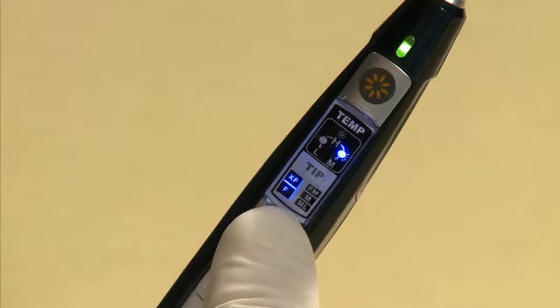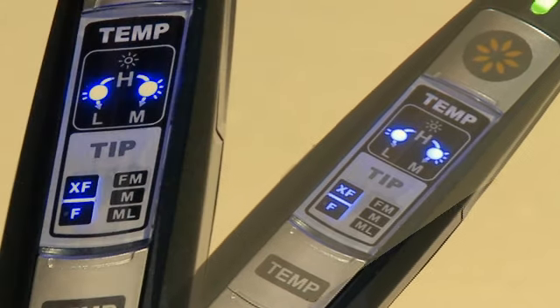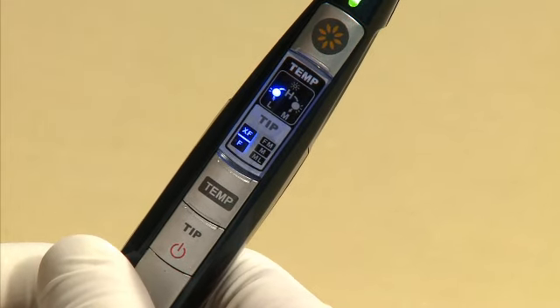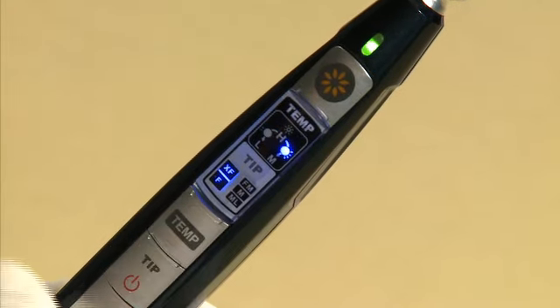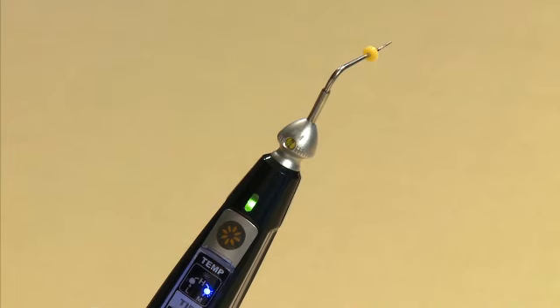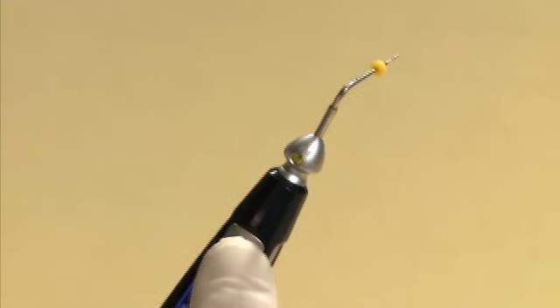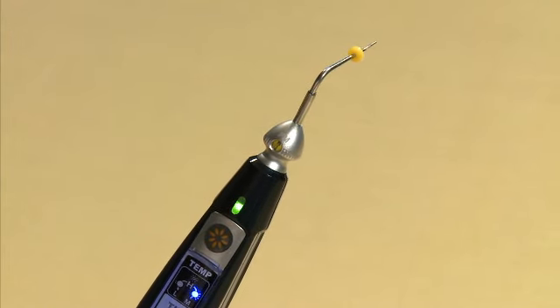Pressing once will change the temperature to the high setting, and both the L and M indicators will light up. Press once more and the temperature will change to the low setting — the indicator above L will light up. Press one more time to change the setting back to medium. After setting the temperature, press the operation button to initiate the pen tip to heat up. Releasing the button will stop the heat and the pen tip temperature will cool down.